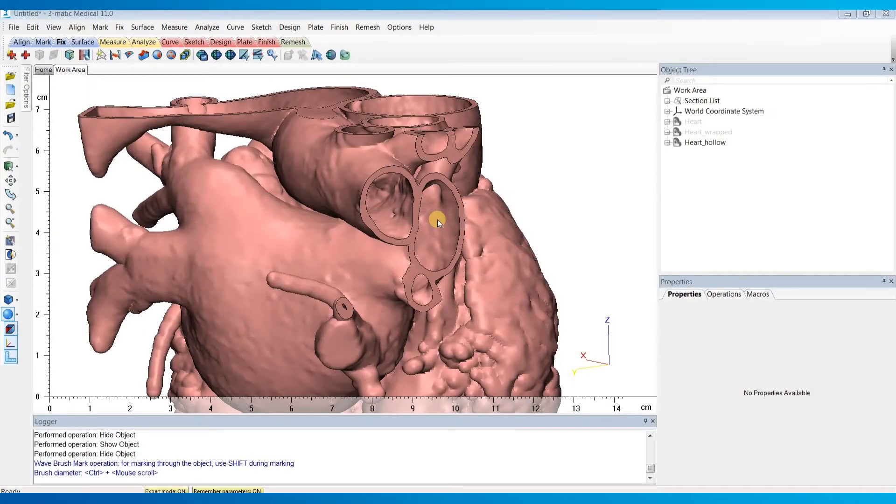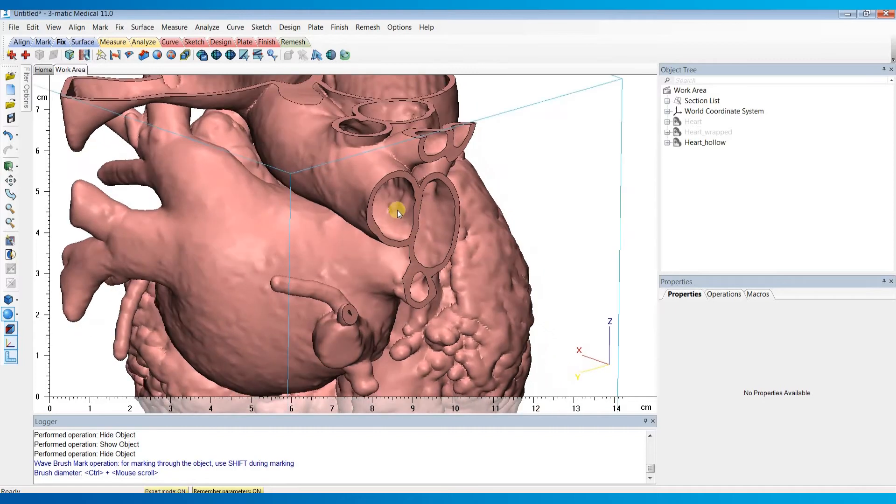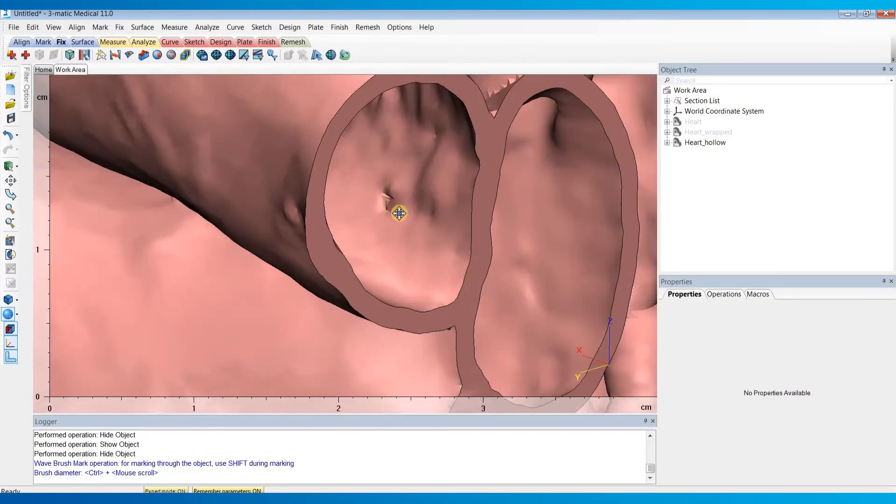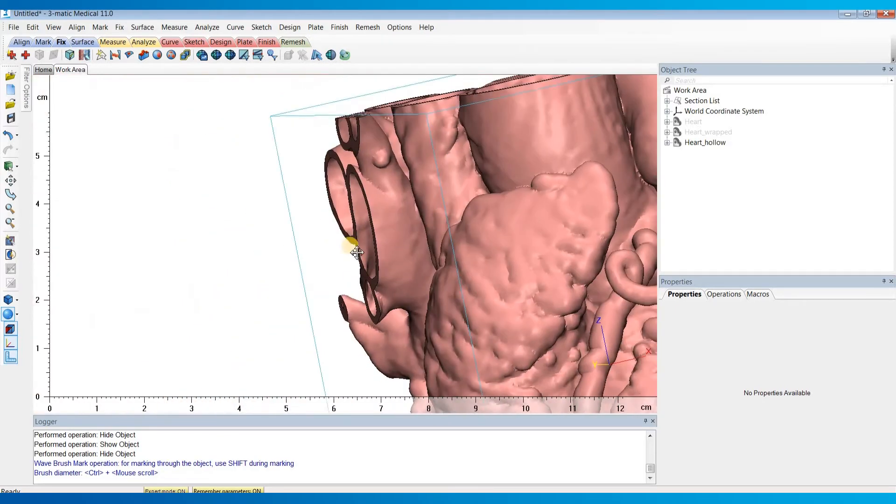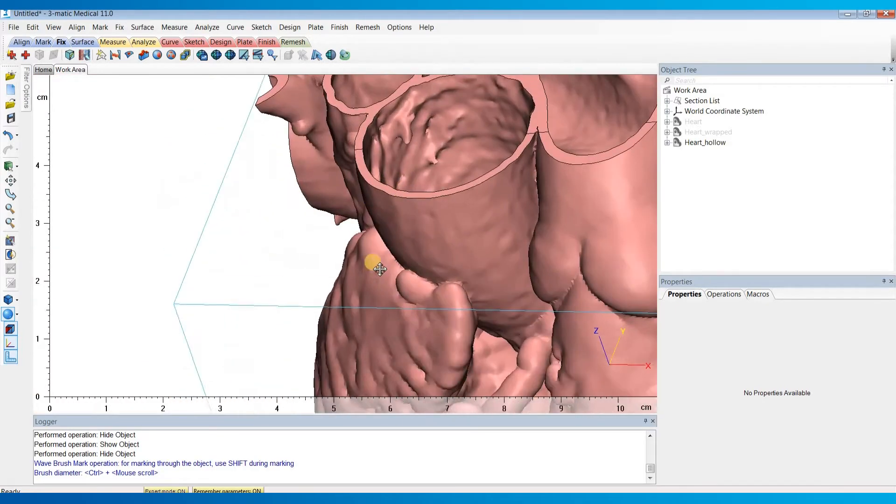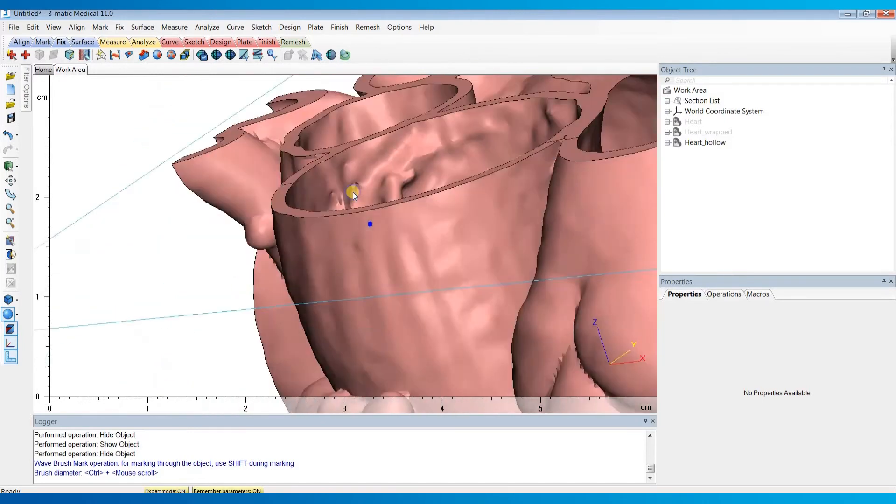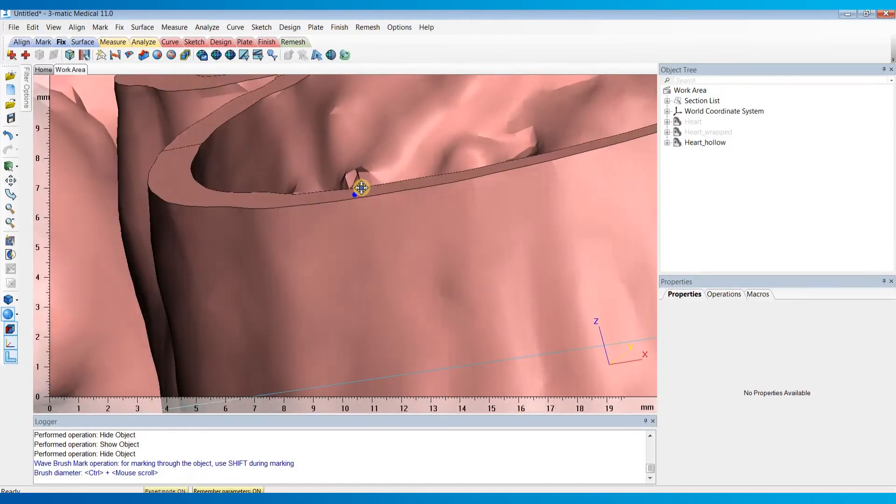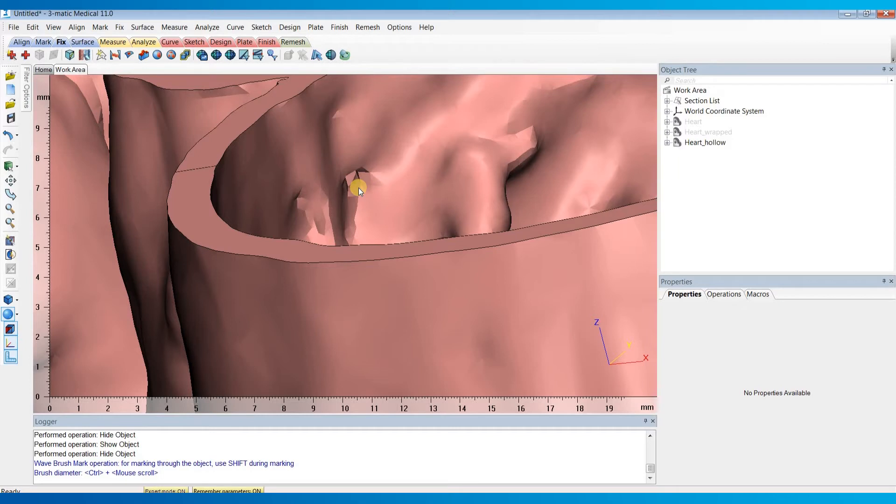A common problem that I see in a lot of hollow models are holes or connections that shouldn't exist. Here you can see an example where we have some small holes between the pulmonary artery and the pulmonary veins, as well as some holes that exist between the SVC and the aorta. In reality, these holes aren't present in this patient, and we'd like to have a model that's true to the patient's anatomy, so these are things that should be fixed.